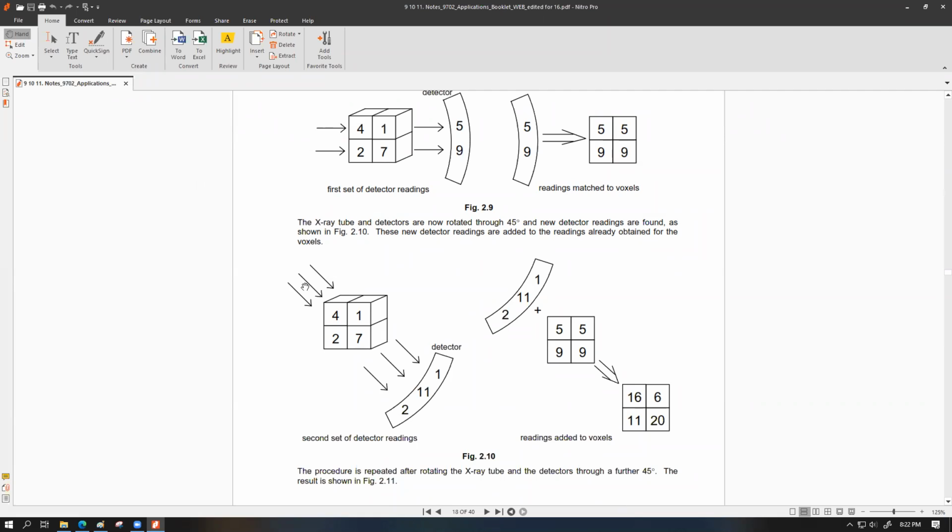To make the CT scan possible, you are going to scan the patient 4 times within the same machine. This is why CT scan machines usually look like those very round things where you make the patient lie down.